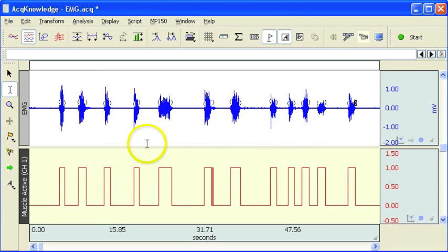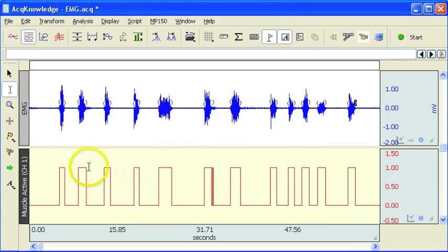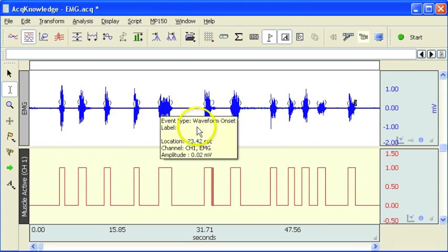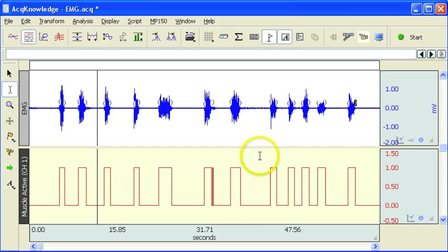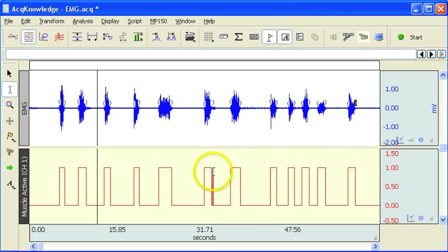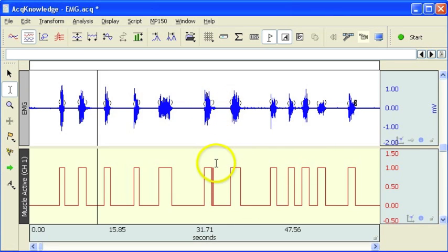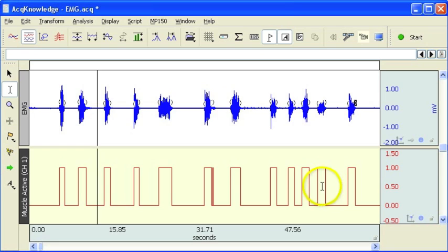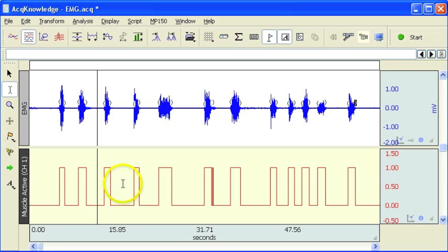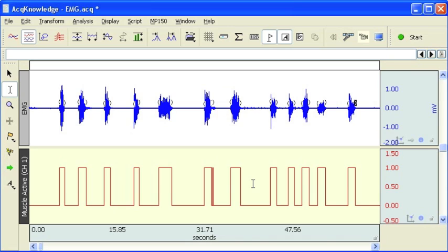So here we have it. The software's gone through and it's identified periods of EMG activity. And we can see it looks like it's triggered on some noise here. But it's not a bad effort for doing an automated analysis.